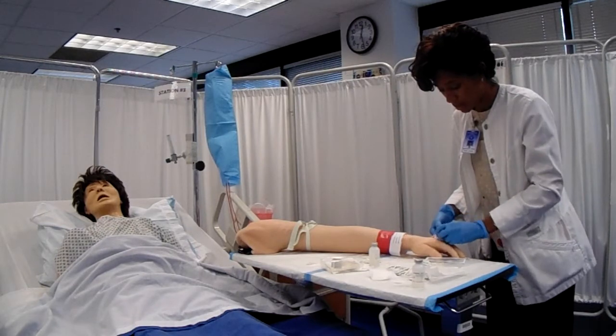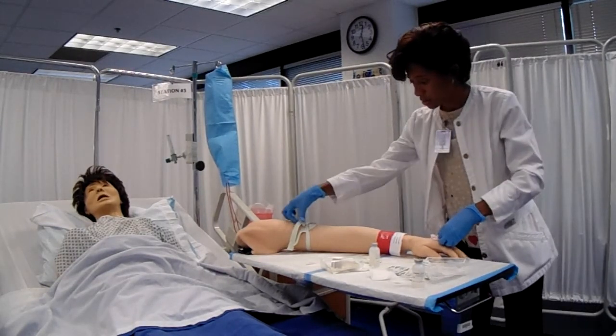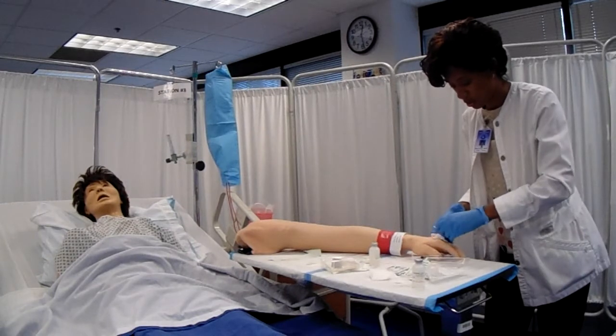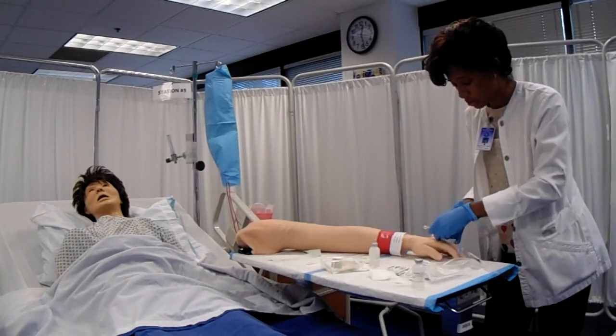I'm going to go ahead and apply my gauze pads to catch any possible leakage. At this time, I'll remove the tourniquet and I'm going to connect my tubing.